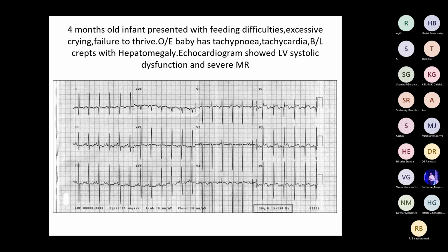The ECG was taken a long time back, but even that was missed. Even the deep Q waves are there, that has also not been taken into account. And the child is operated now, growing well, gaining weight well, and doing very well. Ejection fraction was initially 25%, now it's 40%, 45%, right? Otherwise, they were given the death certificate. Death certificate means they were counseled that this will not recover because of dilated cardiomyopathy. Yes, in the first presenting early in life, most of them are dead and gone by 1 year.